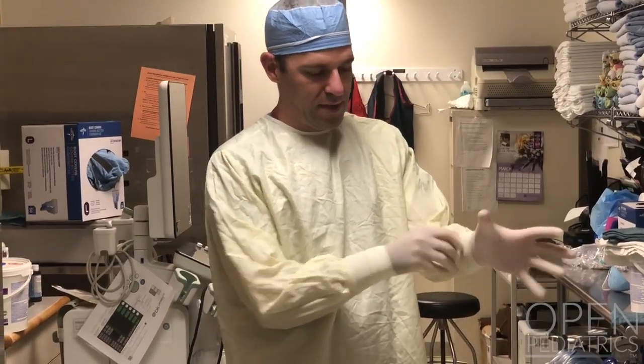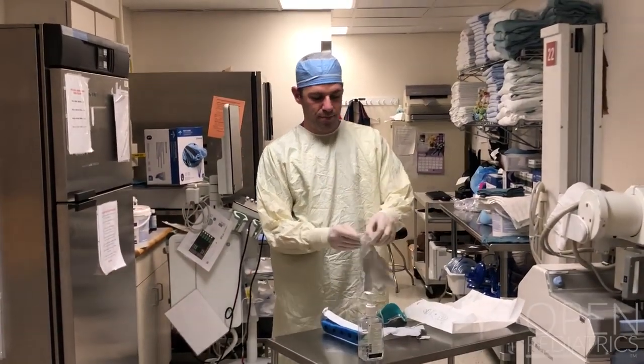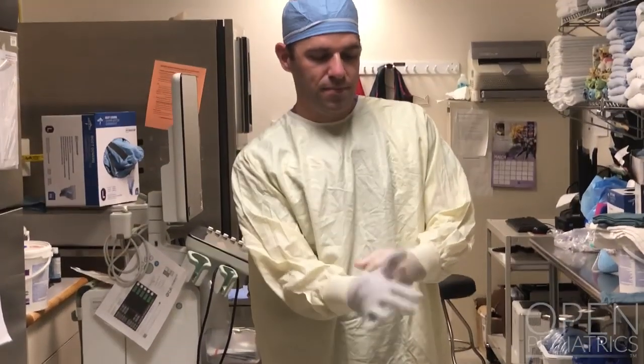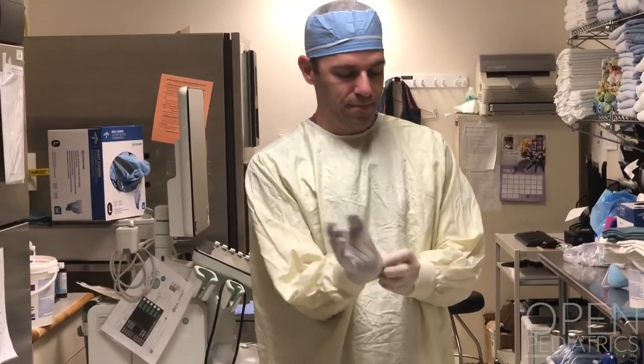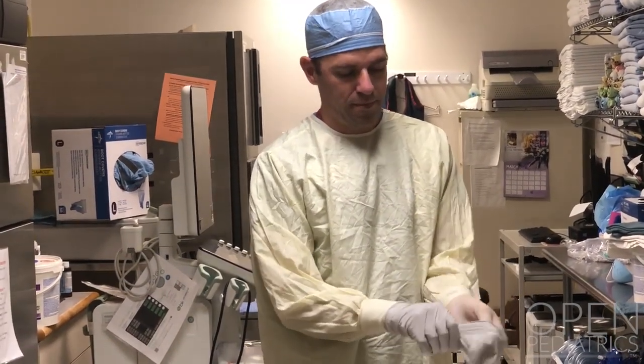Now you want to don a pair of nitrile exam gloves, the same as we would use in normal operating room procedures. The reason for a second pair of gloves in anesthesia and airway management is that we will use the glove to resheathe dirty equipment.